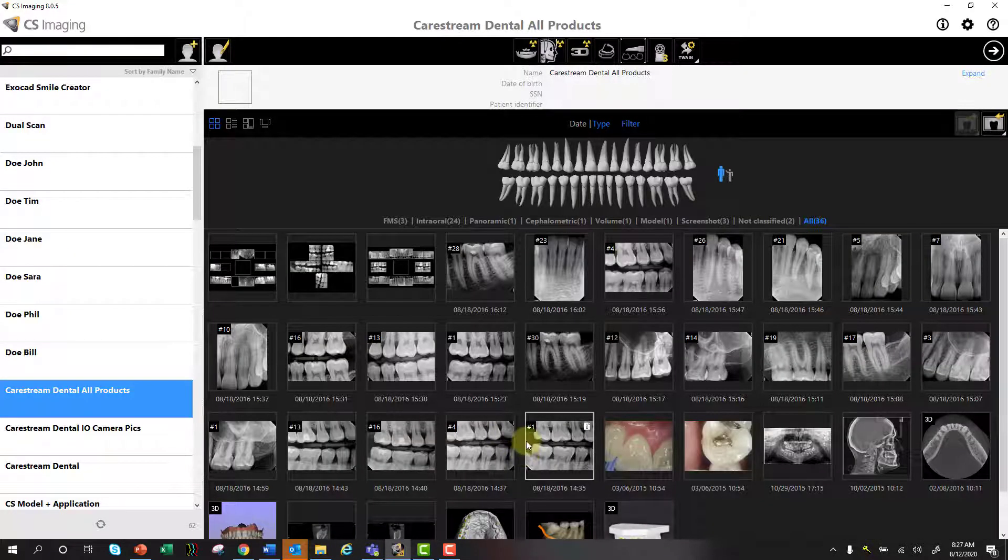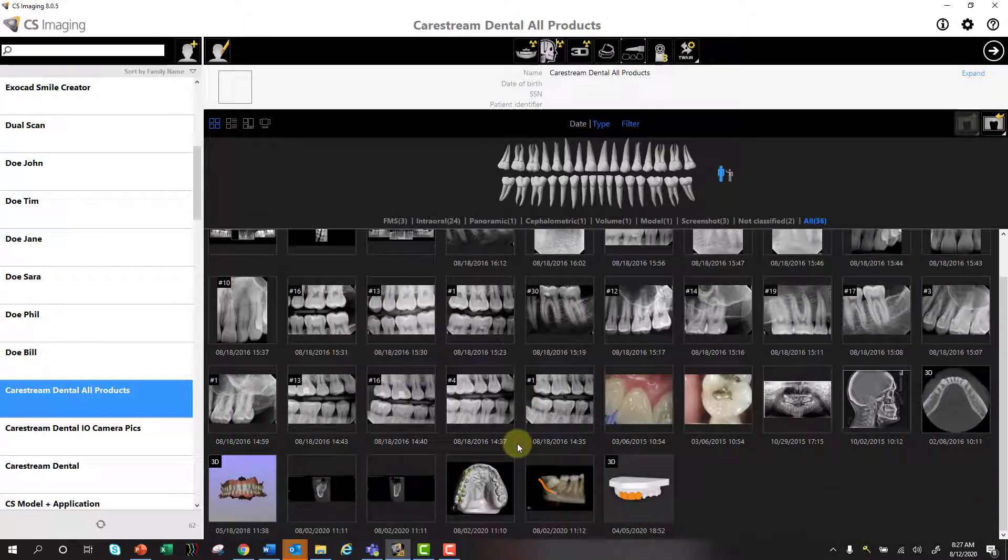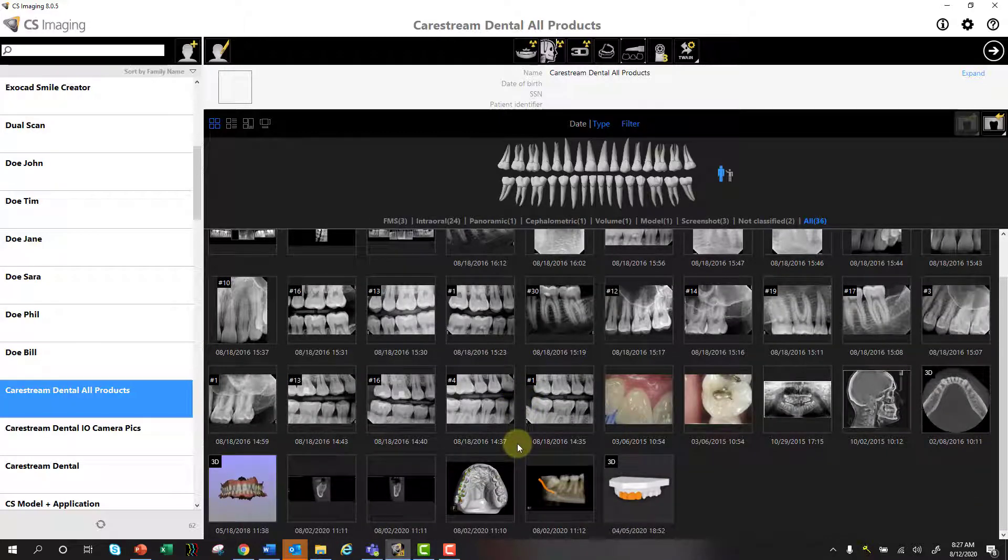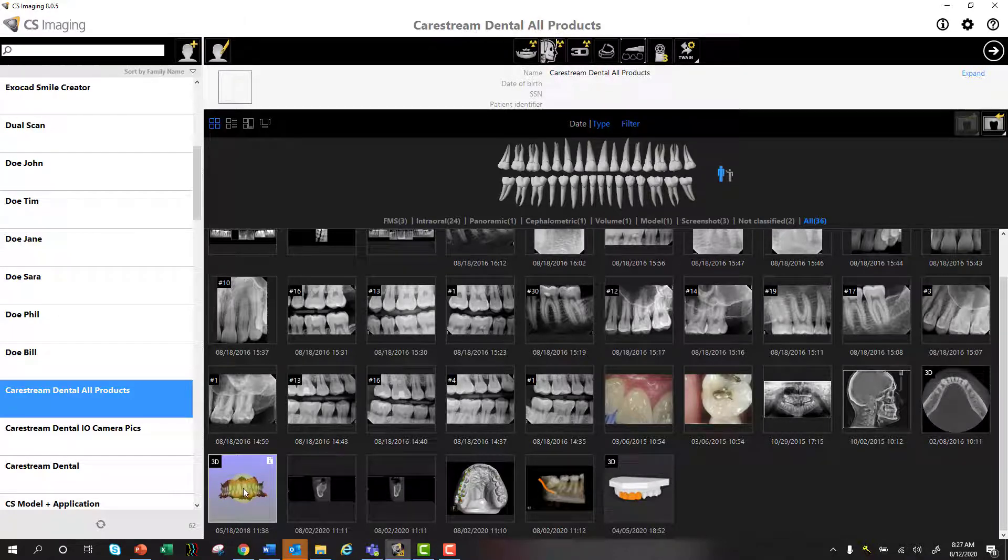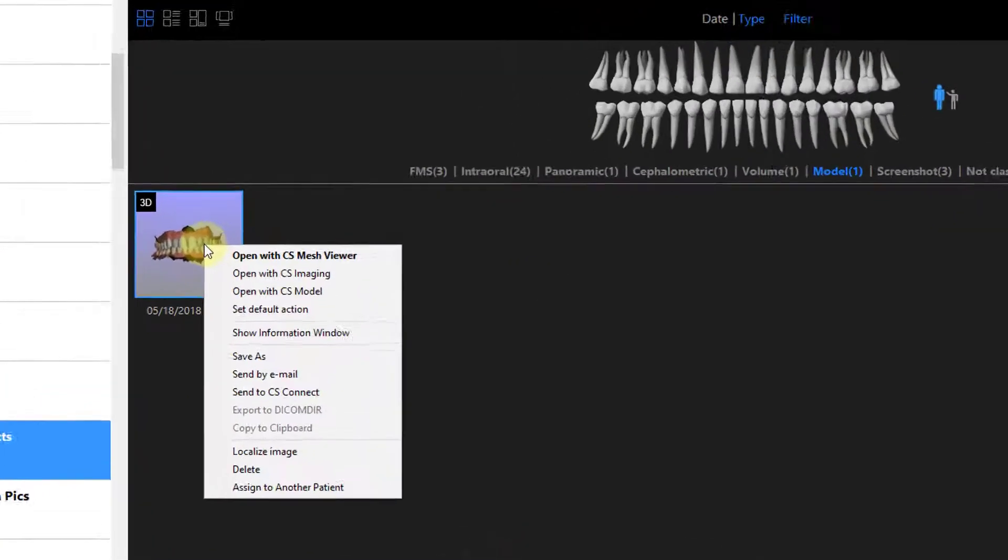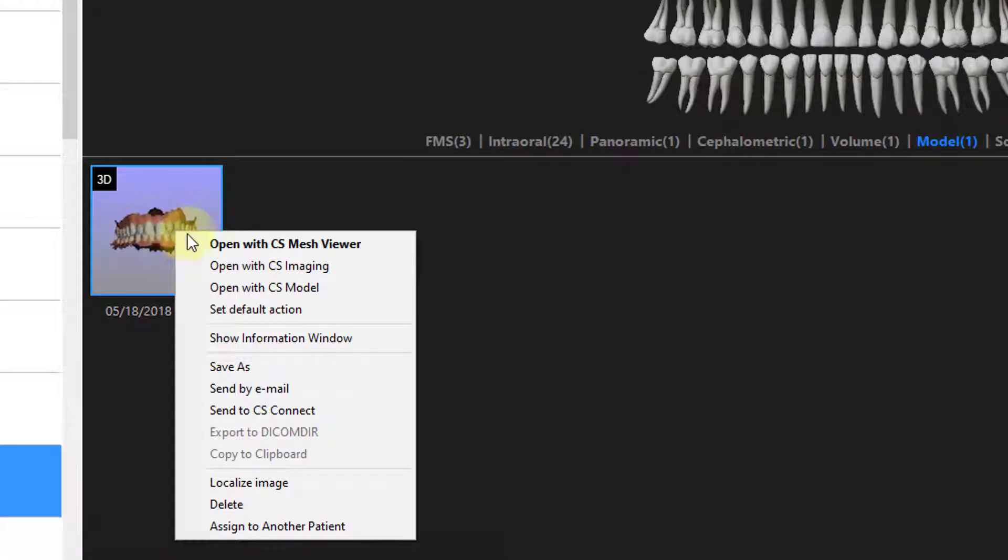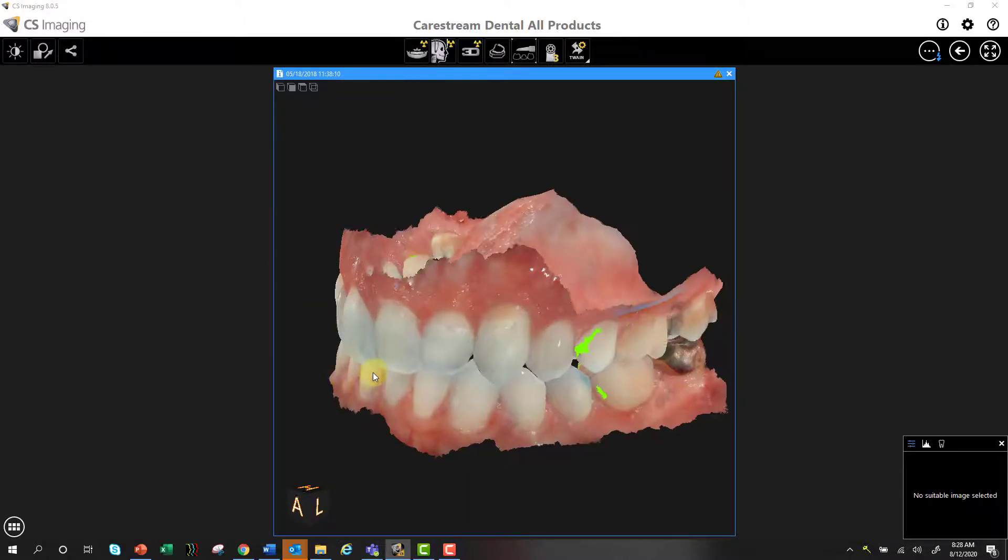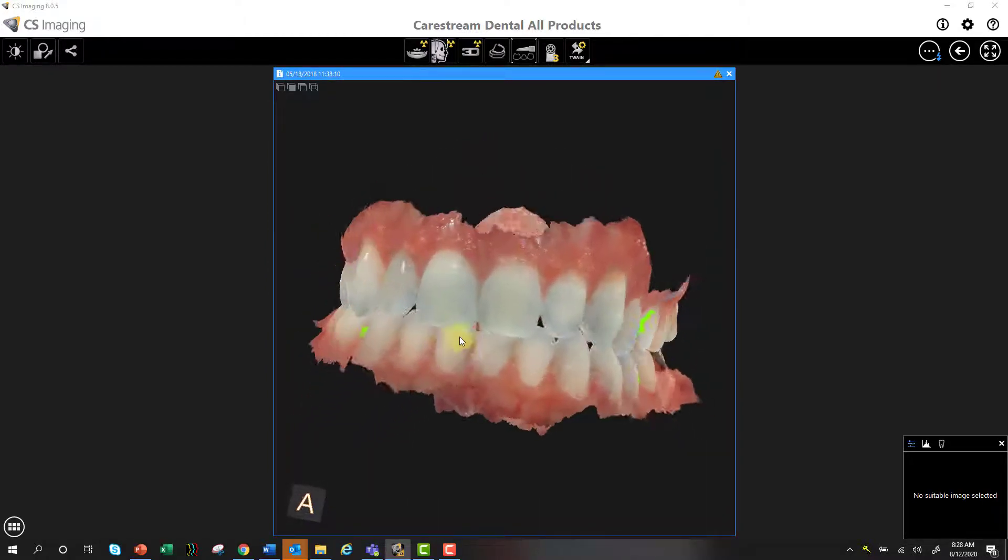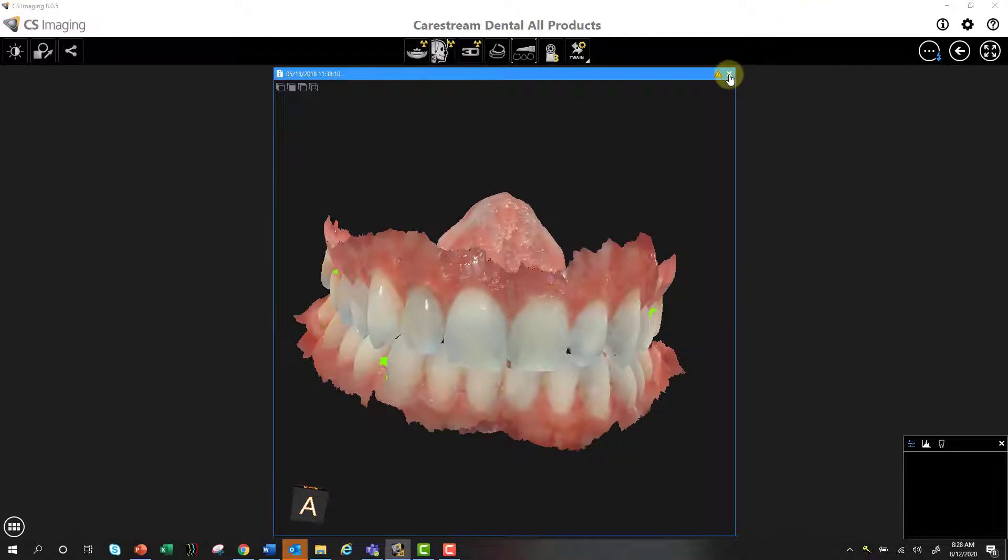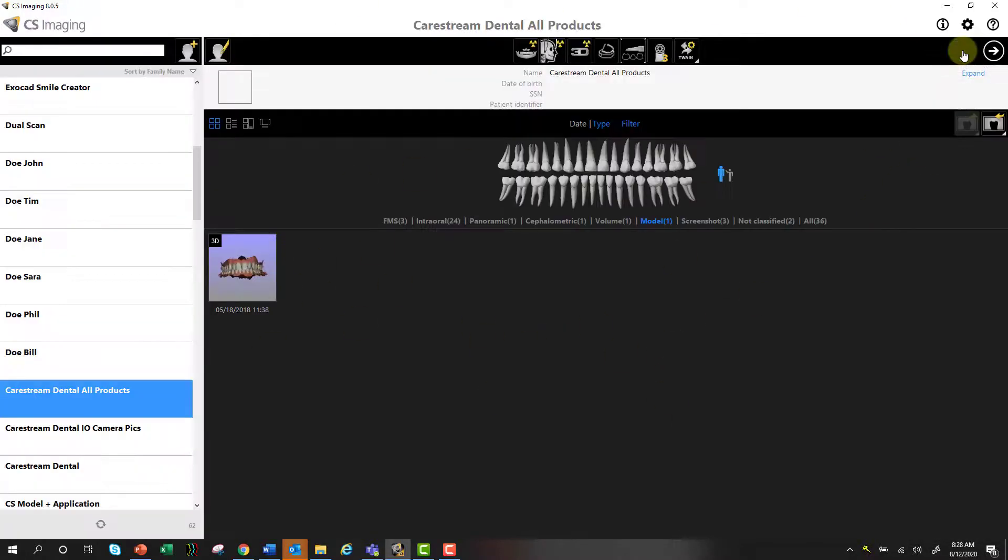CS Imaging is just a quick viewer when you're looking at either cone beams or digital impression files. For example, I have Mesh Viewer as the default. So if I double click this, it's going to launch Mesh Viewer. This is going to be my digital impression file. I can still launch other programs by right-clicking and selecting which program I want to use to view that image. CS Imaging is just a quick viewer of that digital impression file. So it just takes a second for it to render, and now I can view my digital impression file in a very basic viewer. This is my back arrow to my browser. So once I launch into Imaging, to get back to my browser, I click that back arrow.